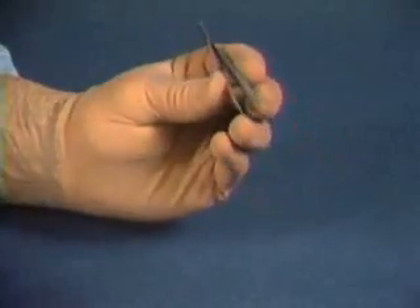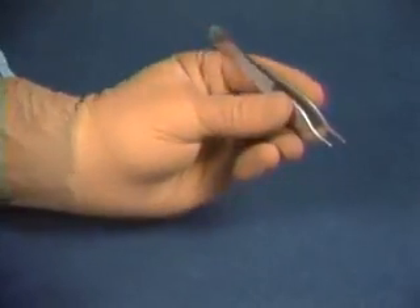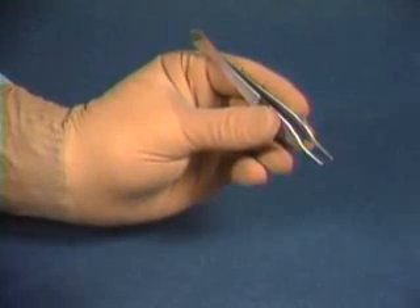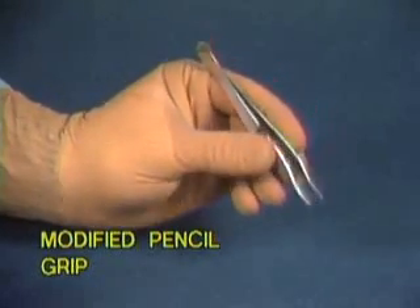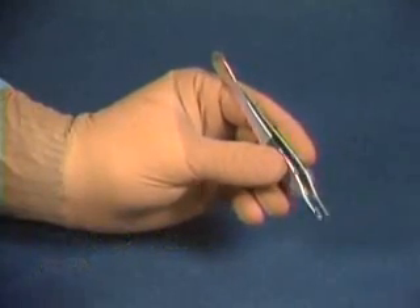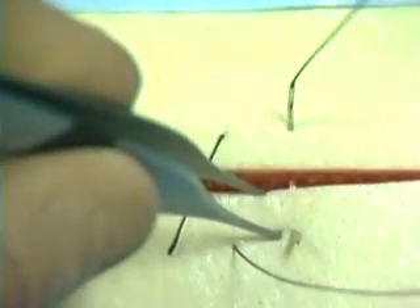Thumb or tissue forceps are grasping instruments that are used to assist instrument maneuvers of the opposite hand, which may be holding a scalpel, scissors, clamp, or a needle holder. Thumb forceps are usually held with a modified pencil grip. With this grip, the shanks of the forceps are resting against the index finger's metacarpal phalangeal joint, and each blade of the forcep can be used as an extension of the finger it rests against.